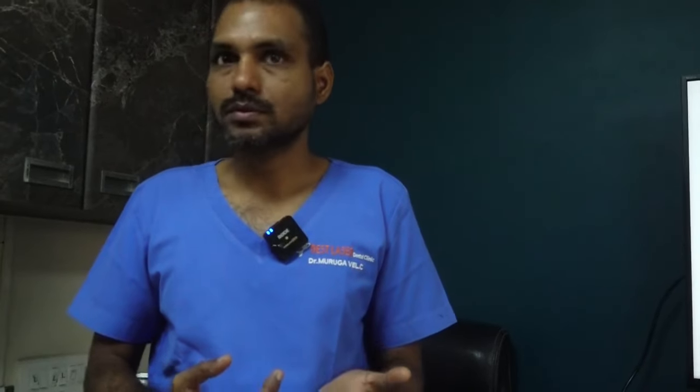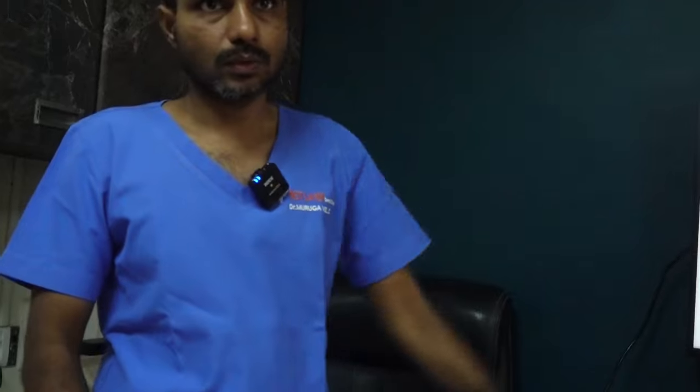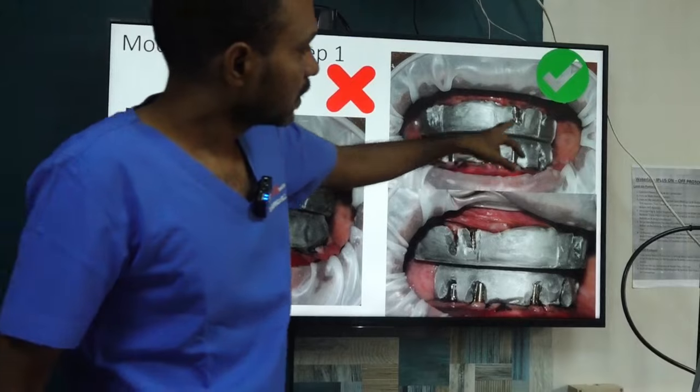What is the modification? Many doctors were telling us they couldn't scan the bite rims, they couldn't do intraoral scan. Many doctors were discussing with her. Their main challenge is they couldn't do the implant scanning first, they couldn't do full arch implant scanning, and they couldn't do the scanning with the bite rims. So how we avoided those problems, we are going to tell now. The implant scanning, the first step, is over. So the first modification is exposing the implant neck.